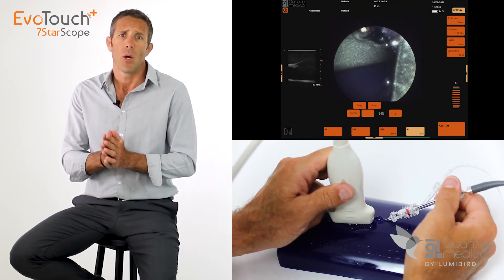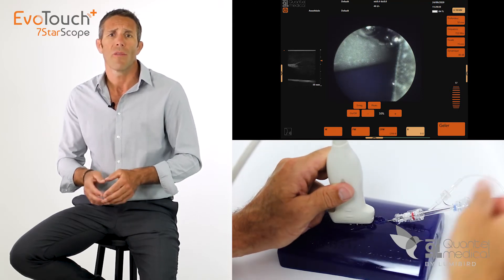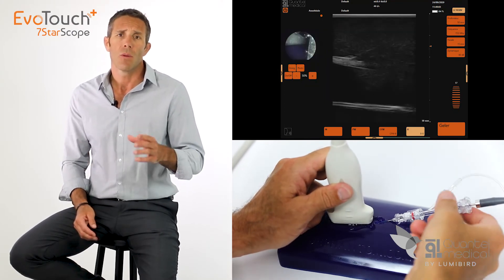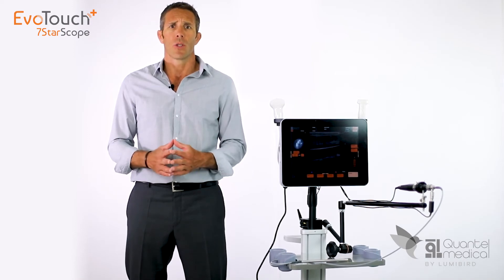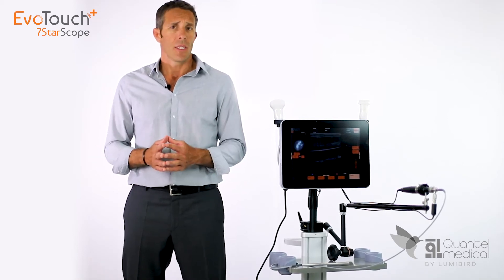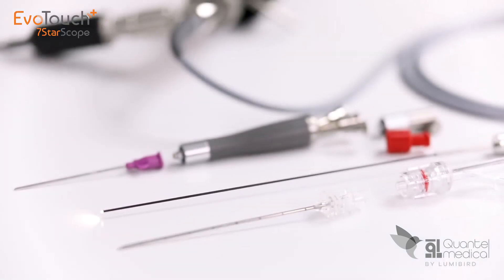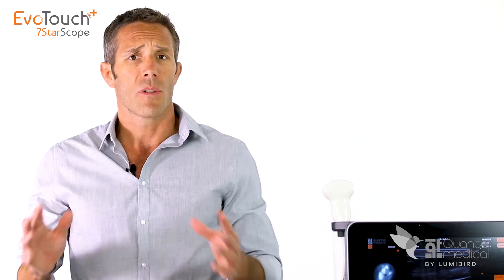The image quality and extreme precision of the EvoTouch Plus 7StarScope will allow you to perform injections or punctures with unprecedented comfort and precision. This revolutionary new combination between an ultrasound scanner and a micro endoscope will open up new possibilities in many medical fields. Indeed, which doctor has never dreamed of putting their eyes directly at the tip of their needle, in order to switch from blind techniques to techniques with direct and instantaneous vision?